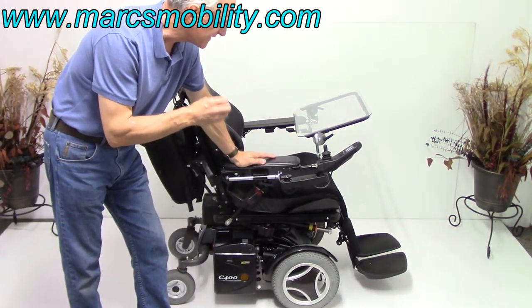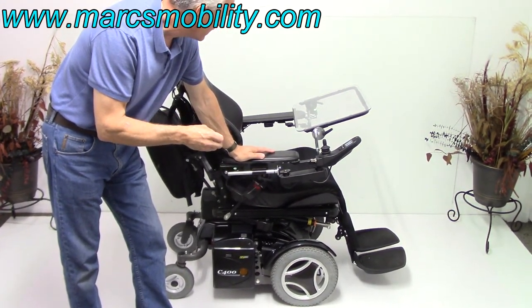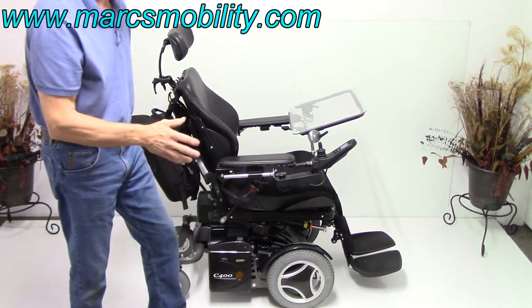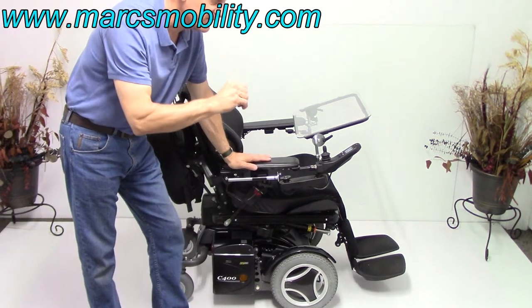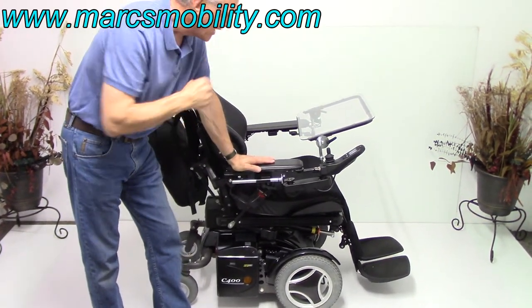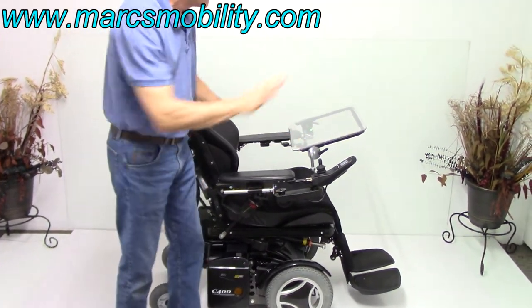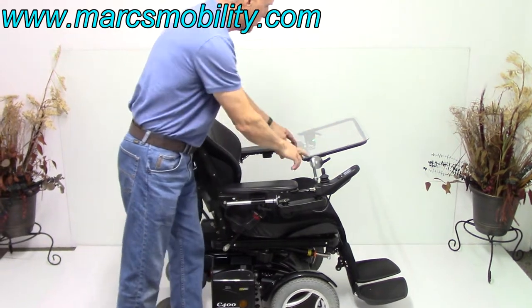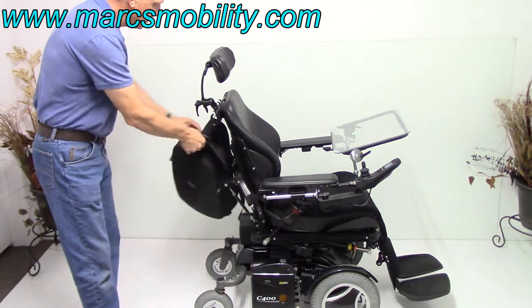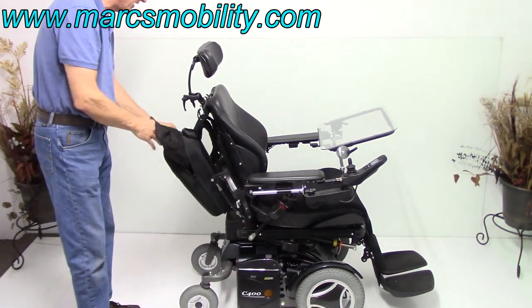This is a Permobil C400 ESP power chair — the ESP stands for enhanced suspension on this chair. Now this chair has everything: it has the 8-inch seat lift, the electric tilt, the electric recline, and the electric legs. It also has a tray right here that is adjustable — it can be flipped down and removed. It also has a carrying bag in the back with all the manuals and all the tools for the chair. Everything is in there.